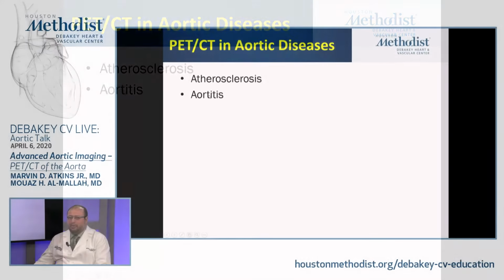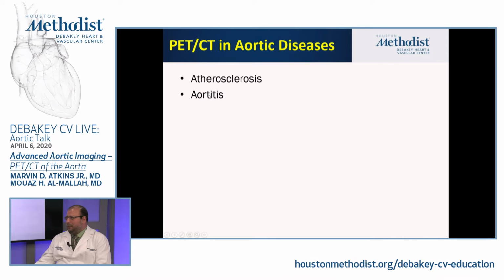Now, the hallmark where PET-CT, I would say, would be the most useful test clinically, and it has been used clinically, is among patients with inflammatory aortitis. So we're talking about giant cell arteritis, Takayasu arteritis. This is where it's going to be very helpful to pick up these patients, and it's very helpful in these patients not only to make the diagnosis, but also to follow them up and titrate their therapies. I'll show you some examples with that.